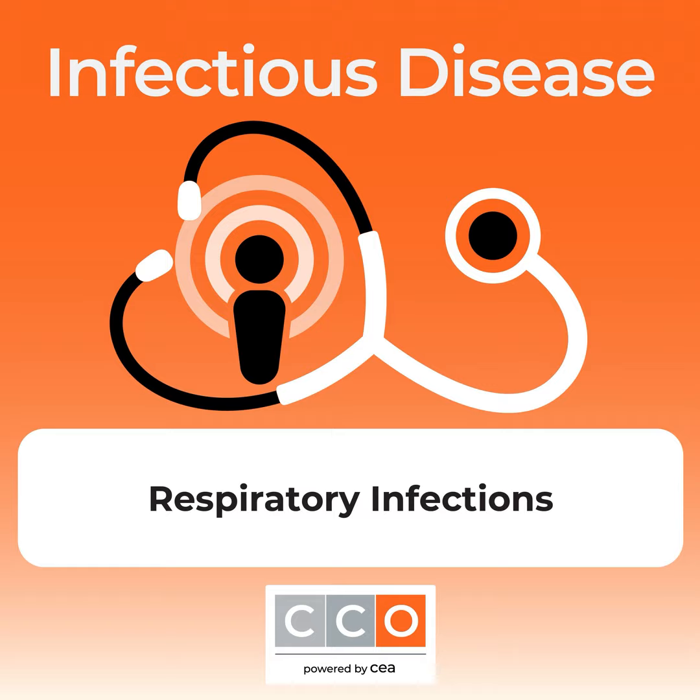So I'm going to give an example. Sometimes these syndromic panels can have so many targets, and it can be challenging to know how to report the results. I'll give an example here of how we report the results. We like to report all of the different targets that are detected by the assay and then say whether each was detected or not. We do this because we think it's important for clinical teams to know not only what was detected, but also what wasn't detected.